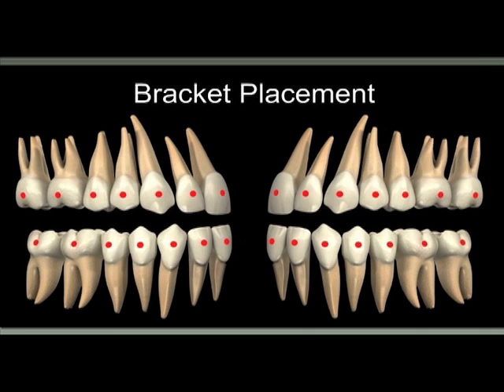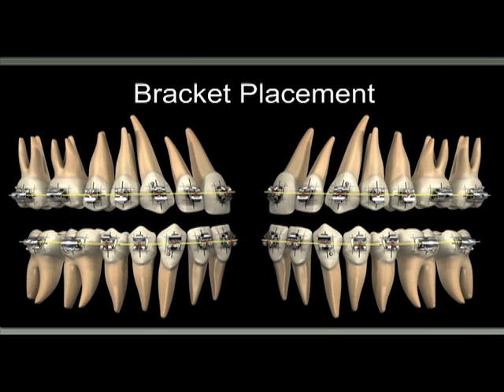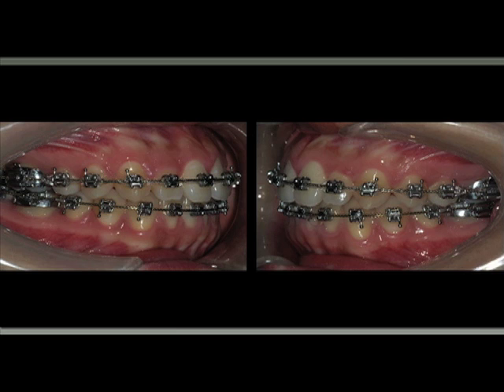And the idea is that when the teeth are all perfectly aligned in the arch, you have all these dots basically tied together with a line that could basically be a wire. The challenge for the orthodontist is to be able to place the brackets on top of this FA point, and so when we are all level and aligned, the case looks almost finished before removing the appliances.